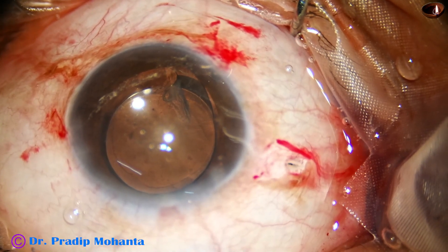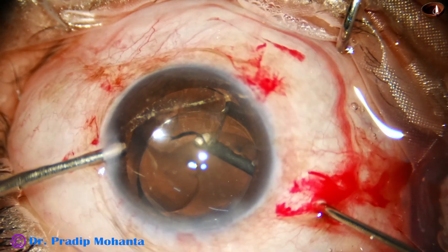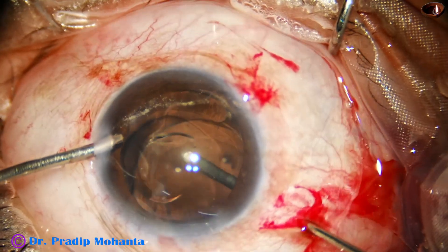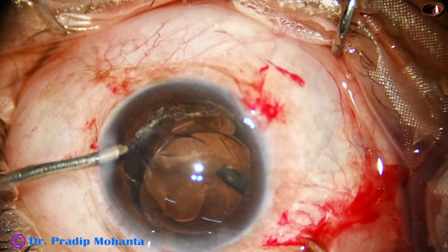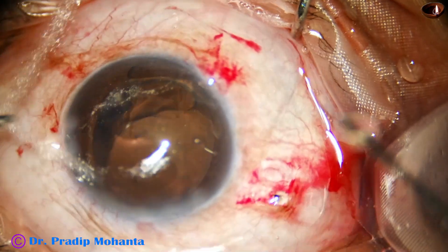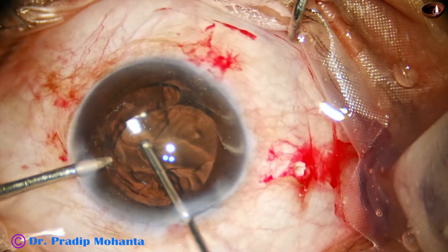I take the 23G vitrectomy cutter. First, check that it is cutting and aspirating nicely. Then I go into the anterior vitreous and do the vitrectomy. Anterior vitrectomy through pars plana is the ideal approach, and all of us anterior segment surgeons should learn this. If we find it difficult to place the trocar in a soft eye, we can just make a small sclerotomy, go into the anterior vitreous with a sharp knife, and do the pars plana anterior vitrectomy nicely.